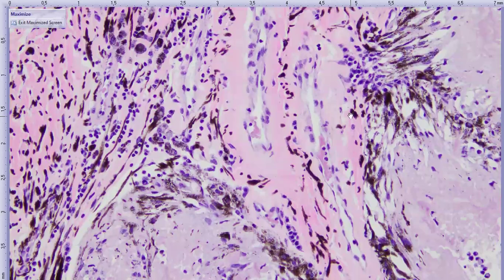So these three things, an amyloid carpet, especially ciliary body amyloidosis, lymphoplasmacytic anterior uveitis, and the linear eosinophilic inclusions are the classic presentation of equine recurrent uveitis. So that's at least how it is diagnosed currently. Basically, the amyloid carpet is the key diagnostic feature, and then you may or may not see the linear eosinophilic inclusions, and you may or may not see an active uveitis in your enucleated globes. For whatever reason, some of these are probably chronically medically managed, so who knows if that impacts things a little bit.